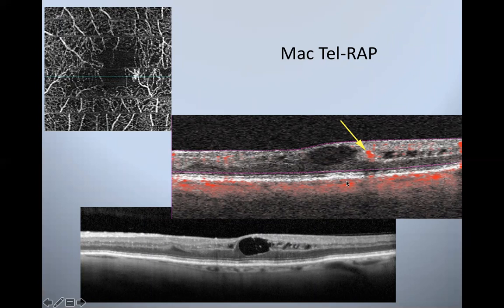And if you look at the OCT B-scan flow pattern, you'll see there's the fluid here that's represented in black. That's not really turbulent. But look at this bright red spot here. That is actually that RAP lesion, that blood vessel that's starting to dive down in here. And it hasn't quite gotten down in here yet. This is a very early start of a RAP lesion.